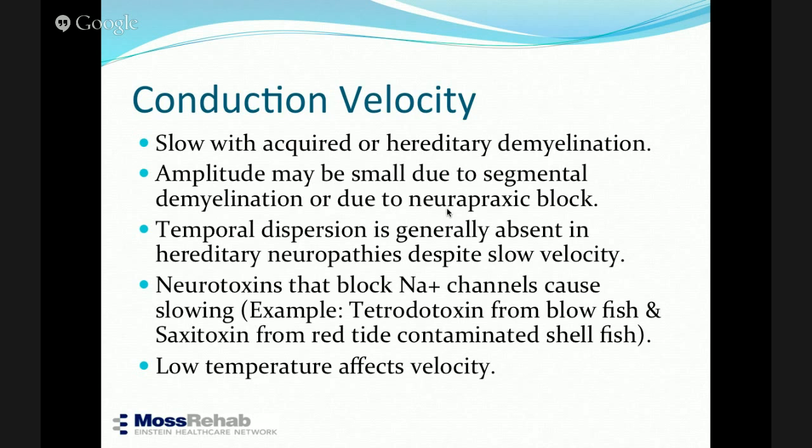On the other hand, in segmental demyelination, where there is patchy loss of myelin in different areas, you stimulate the nerve and the response which arrives at the muscle may arrive at different times. And so there is not going to be summation. And then because they arrive at different times, the response is going to be much wider and maybe polyphasic. So I'll show you a picture of that.